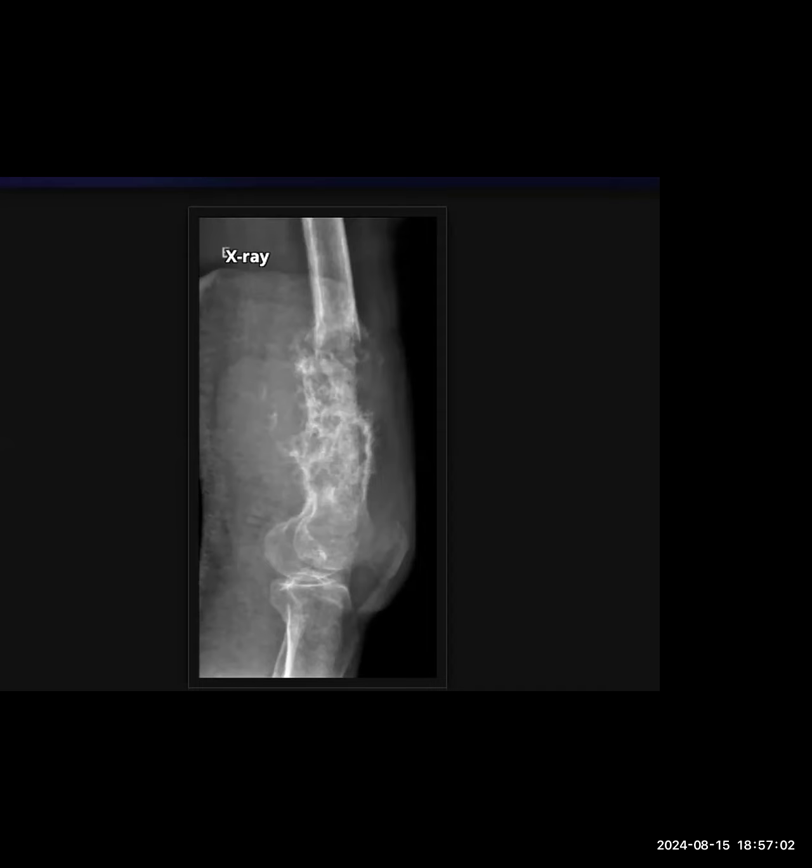So I will inform these findings to the referring team and would compare with the previous radiographs of this patient. I will also evaluate this patient further by an MRI examination to characterize this lesion, and would also see this lesion on the orthogonal views to look for any other finding. Apart from that, this patient will need referral to the orthopedics department and the oncology department with the MDT discussion regarding the further course of management and to plan the biopsy in a bone sarcoma center.